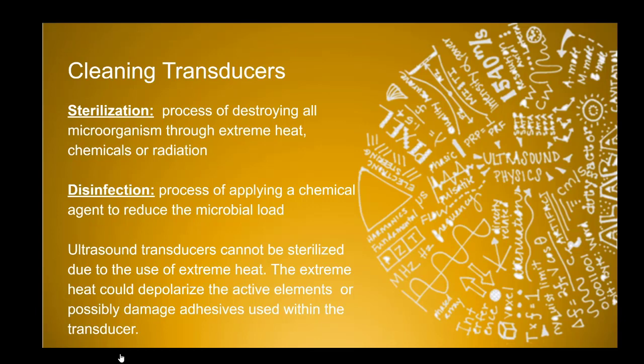And we just learned that we can't expose our transducer to extreme heat because it'll depolarize and no longer work. So we actually cannot sterilize our transducers. So what we end up doing is disinfecting them. Now, disinfection is a process where usually a chemical is applied to the transducer, and what it does is reduces the amount of microorganisms on the surface.